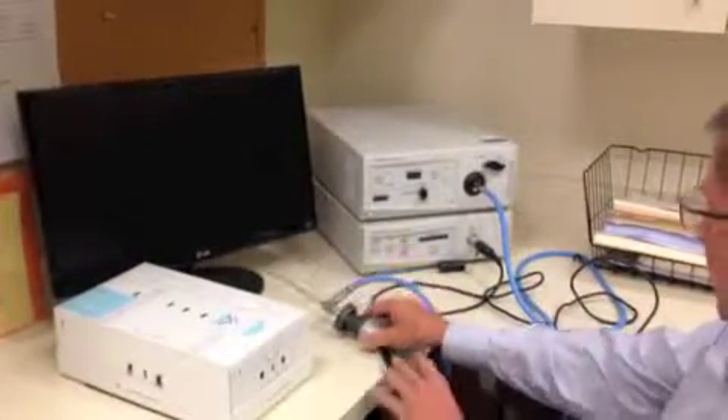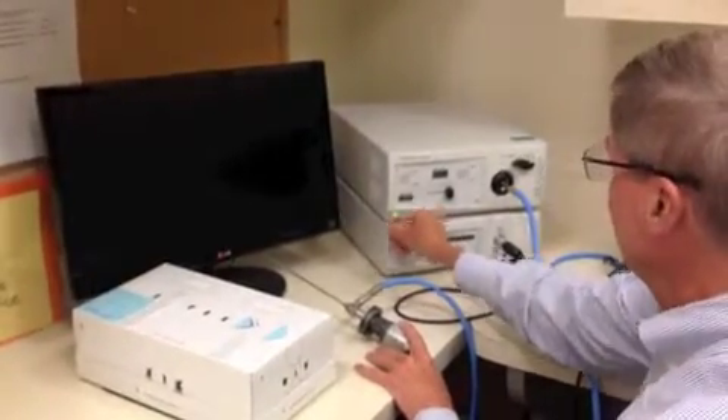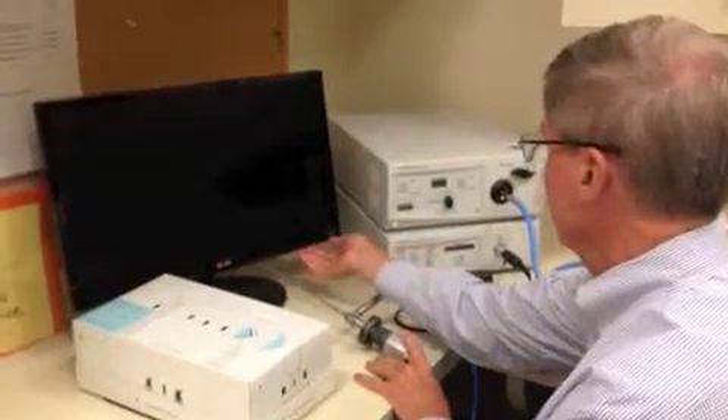This is Arthroscopy Module Box 101. First we're going to turn on our equipment: turn on the camera, turn on the light source, turn on the monitor.